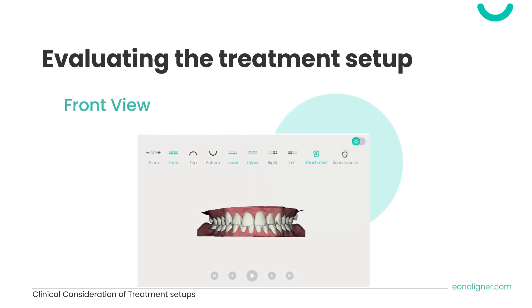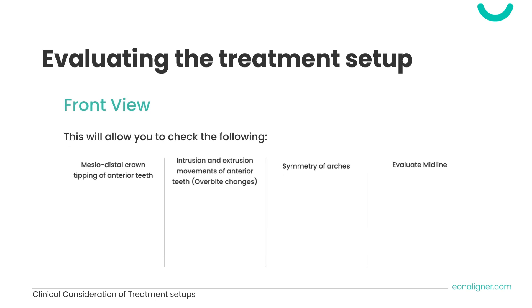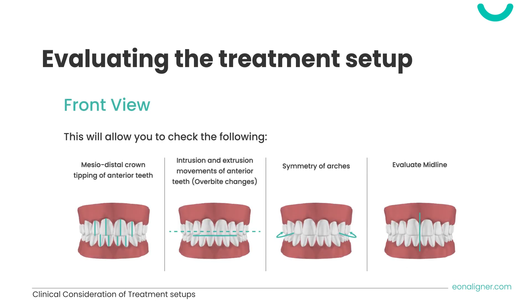The front view is accessed by pressing the front view icon on the upper left corner to get an anterior view of both arches together. You can also press upper and lower icons to view each arch alone from a frontal view. This allows you to check mesiodistal crown tipping of anterior teeth, intrusion and extrusion movements affecting overbite or open bite changes, symmetry of arches, and midline evaluation.